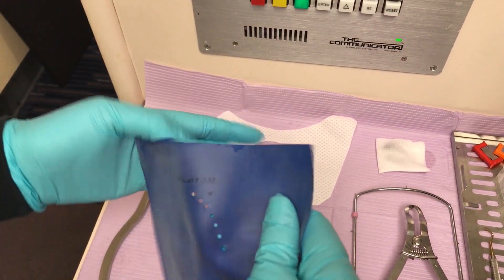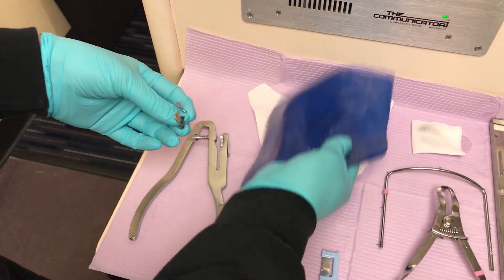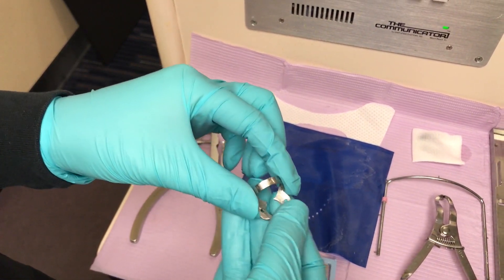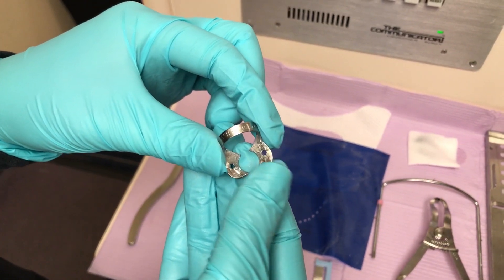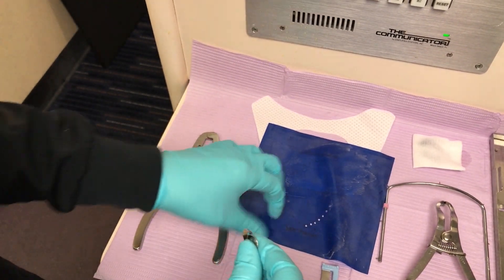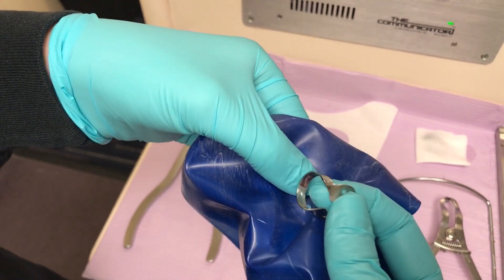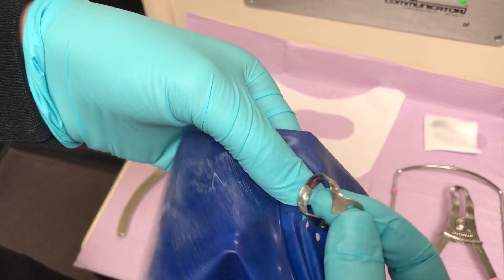Our favorite dental dam clamp to use on a fully erupted molar is the Ash PWUK clamp. It is our favorite because it can be used in any quadrant and is pretty universal. The bow of the clamp is then inserted through the biggest hole, with the bow coming through from underneath and sticking out of the hole.